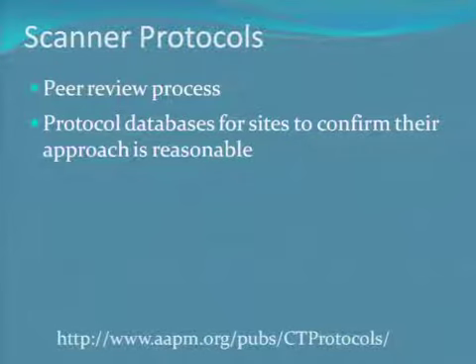They come from the manufacturers. So the manufacturers sort of give us what they would consider their standard default settings, and we all look them over, make sure they sort of make sense.